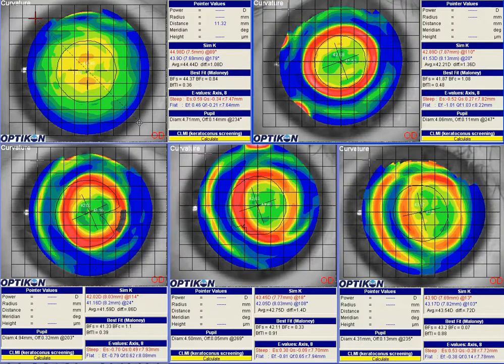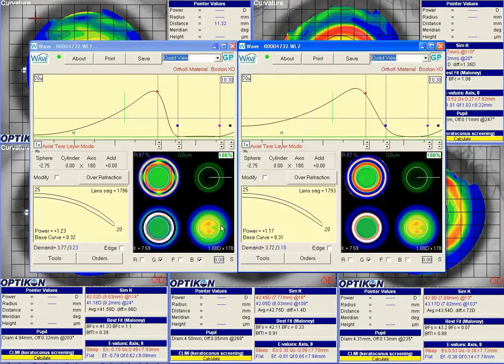So if I bring up the lenses, we've had two different lenses for this patient so far. With the modification, the second lens, I'm seeing a little bit of increase in sagittal depth of the lens, and then also turn the blending back on. And blending on again, I think is a good move. I feel like that does help lenses center a little bit better. And the increased sagittal depth often helps too, although I'll come back and I think we might touch that up at the end.